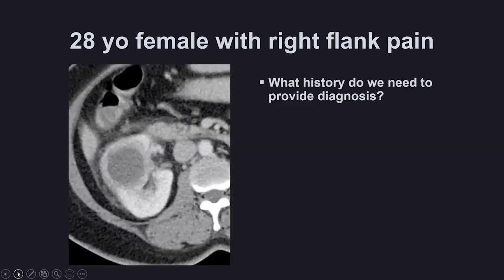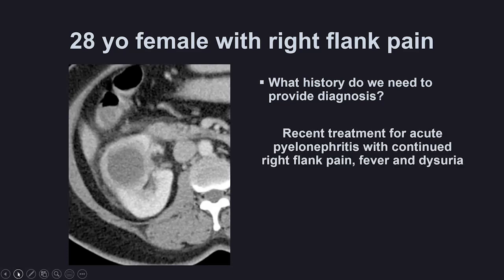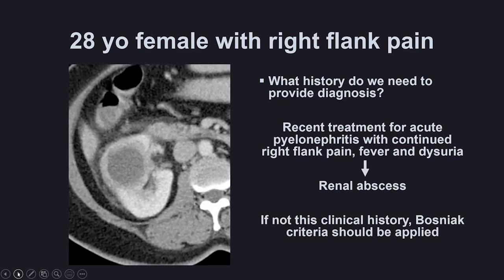Case five: a 28-year-old female with right flank pain and a cystic lesion in the kidney. Clinical history is key here. This patient had recent treatment for pyelonephritis, continued right flank pain, fever, and dysuria. With this imaging appearance and that clinical history, this is a renal abscess. However, if there were no appropriate clinical history for renal abscess, the Bosniak criteria would need to be applied, because this is a cystic renal mass. Clinical history is key to diagnosing a renal abscess.